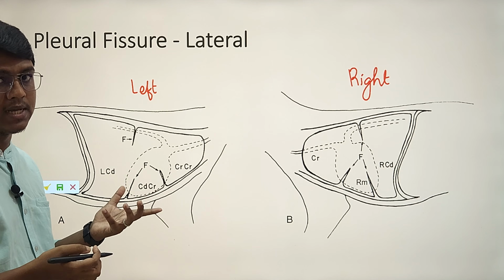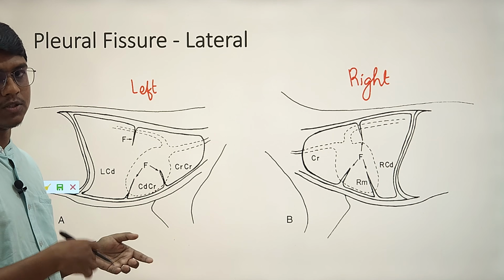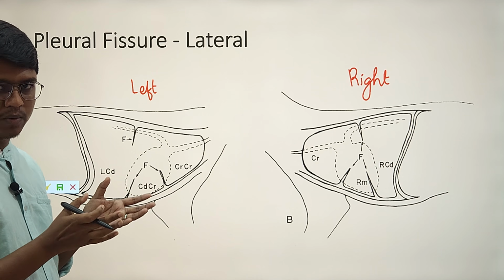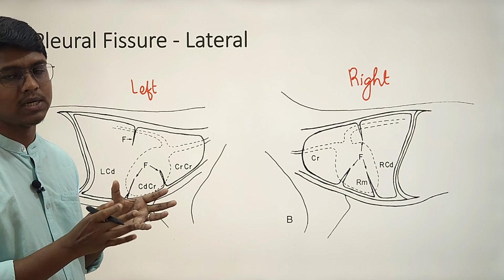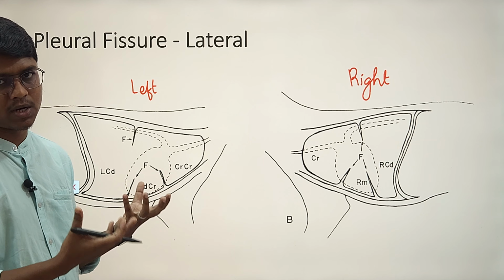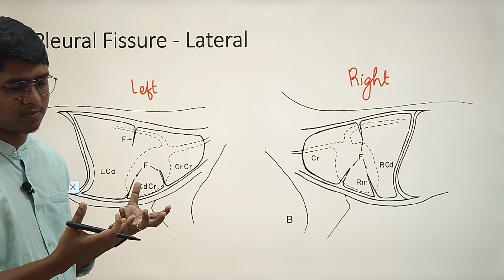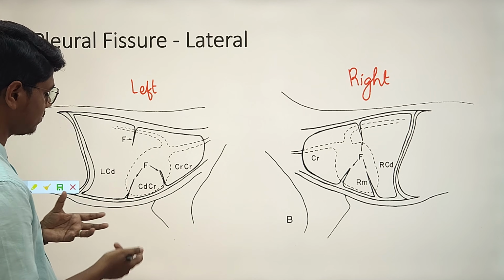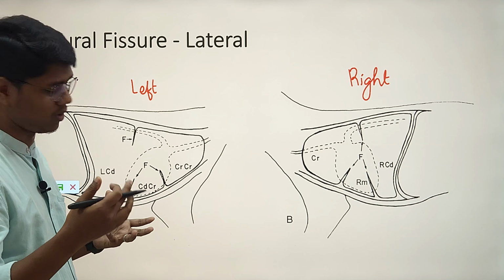I have discussed in interpretation of thorax that the dependent side lung usually becomes atelectatic, or the volume of that particular lung is decreased. Due to that, the radio-opacity of that lung increases and you cannot evaluate it. So basically you are evaluating the contralateral, non-dependent lung.